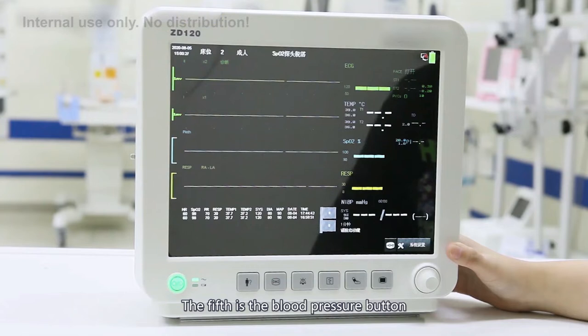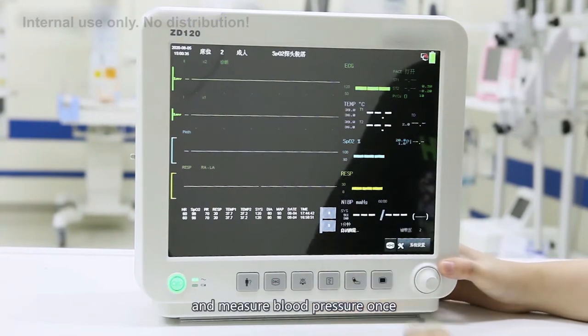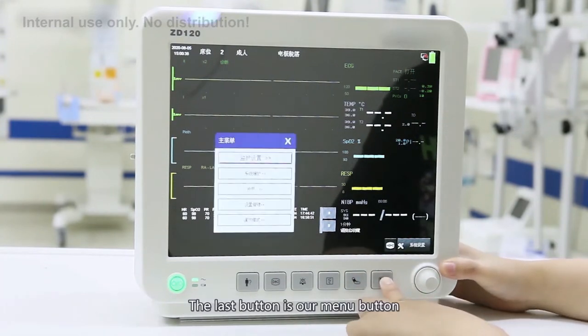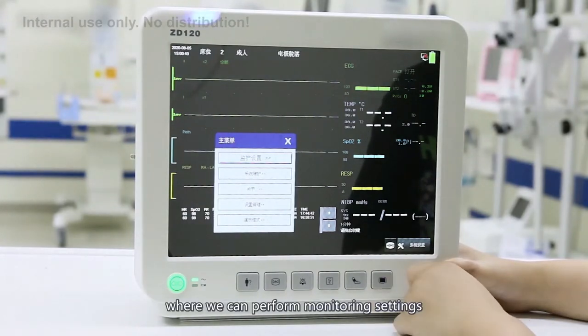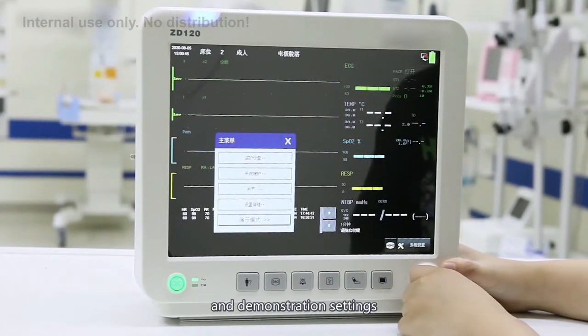The fifth is the blood pressure button. You can inflate the cuff with one click and measure blood pressure once. The last button is the menu button, where you can perform monitoring settings, system maintenance, and demonstration settings.